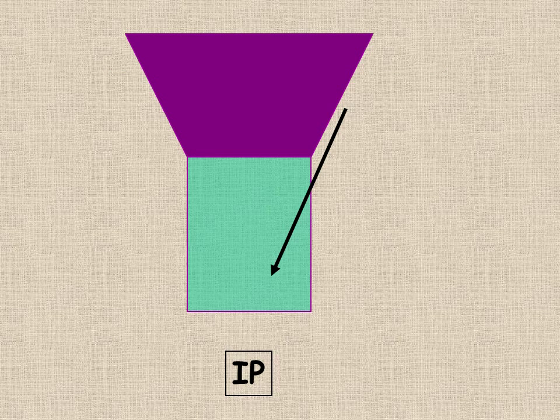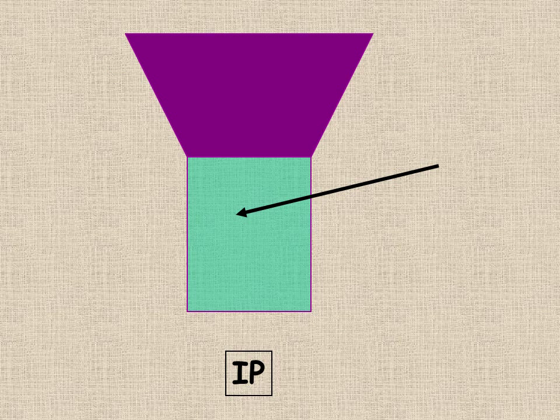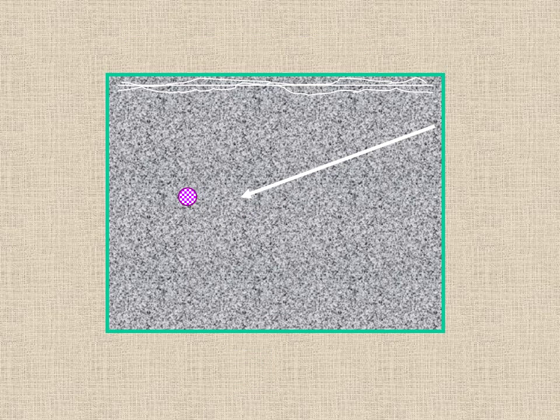With in-plane approaches, there are two things that help with this technique. Firstly, the flatter the needle, the better will be our view of the needle. So the flat approaches give a better view of the needle.